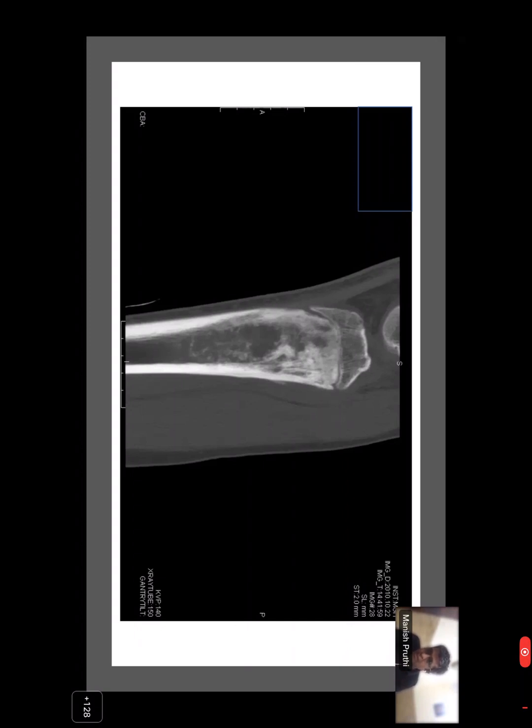The differentials according to the location as well as the age, because NOF will be a cortical lesion, as Dr. Vikram has already pointed out. Osteofibrous dysplasia usually appears in the tibial anterior cortex, so that is also more or less a cortical lesion. Your diagnosis was correct, it's a fibro-osseous lesion, but you have to see whether it's a medullary lesion versus a cortical one. There your differential changes completely, and then you would have been much closer to your diagnosis. Your reading of pathology was excellent, so I think you should remember some differentials according to the radiology. That will be useful. Thank you, sir.